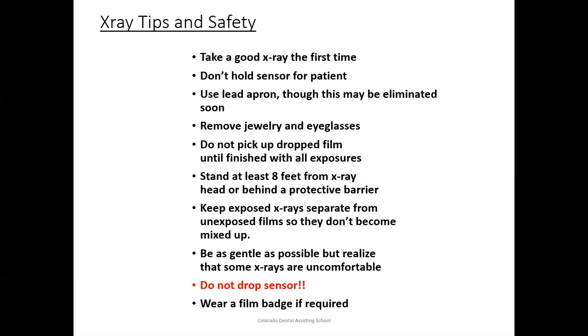Wearing a film badge is important, but it is not always required by all offices. The office you work for will explain to you whether or not you need a dosimetry badge. It will have your name on it. And what that does is it tells us whether or not you're being safe as an employee. So you don't ever want to take it outside because it will be exposed to the sun and the sun will give false readings of radiation. So keep it in the office.